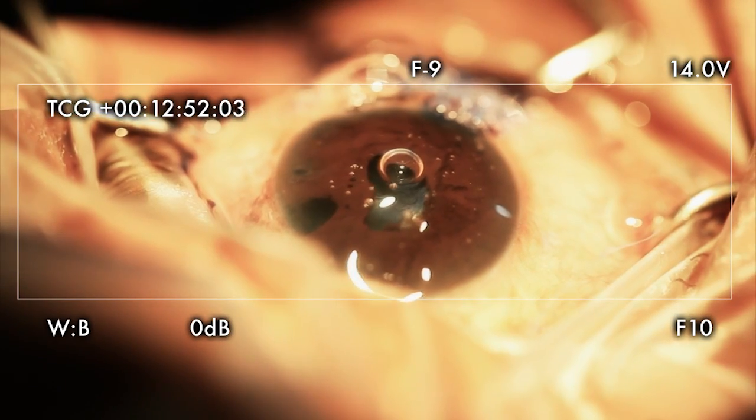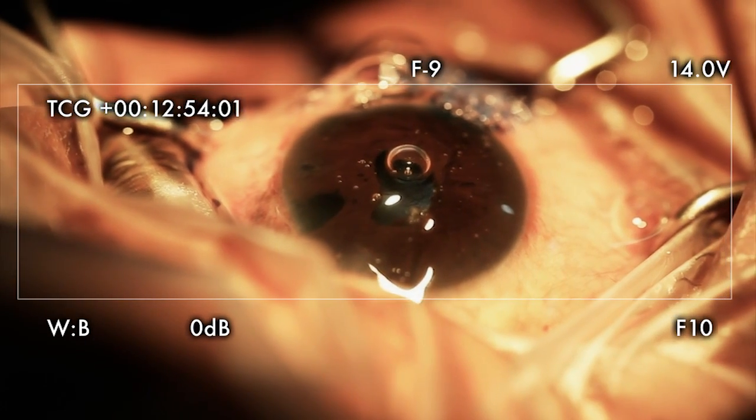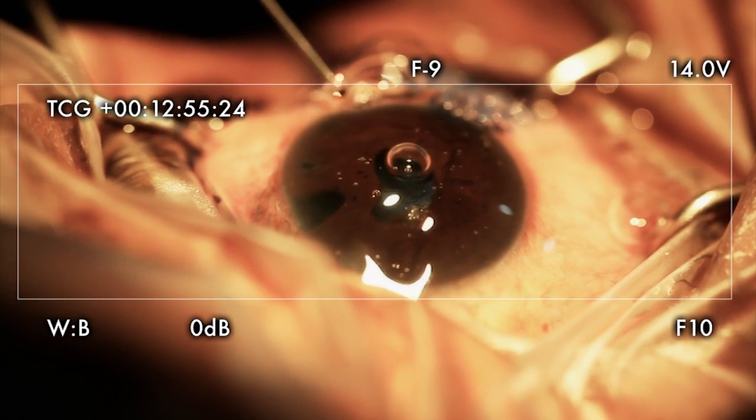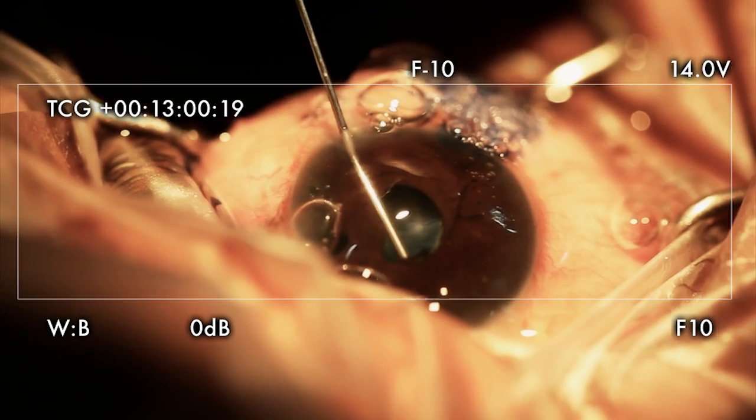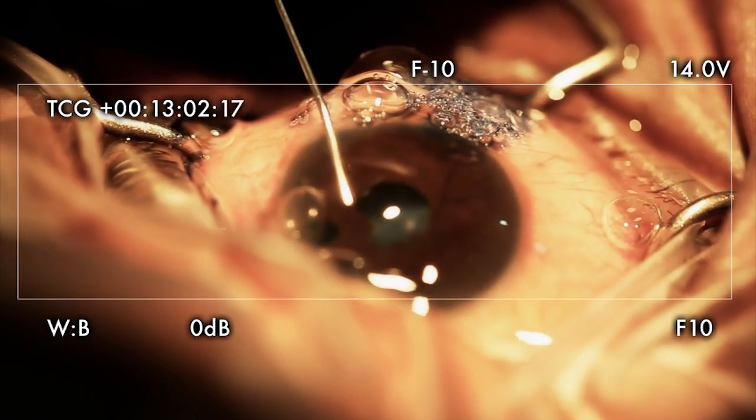Well, I definitely won't have to make a PI because there's a huge PI — from previous surgery. So I'm just going to break the posterior synechia PI.